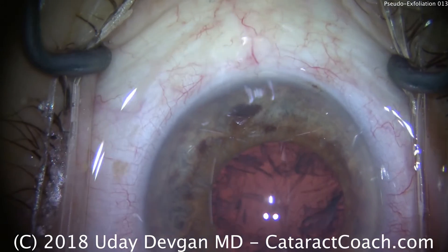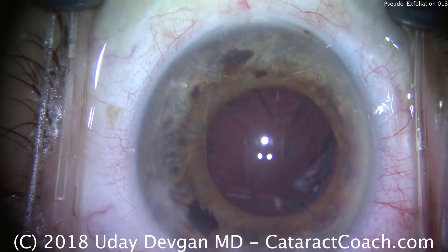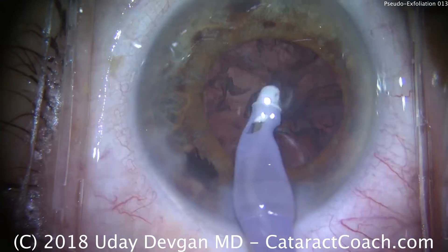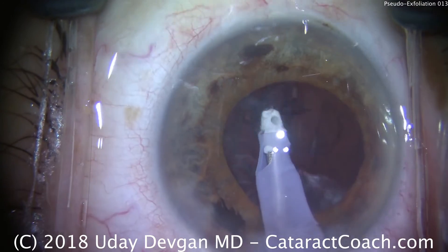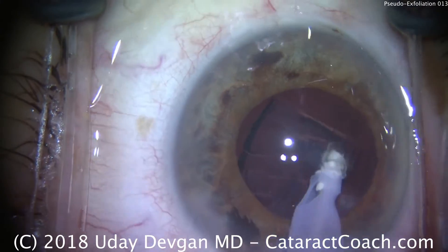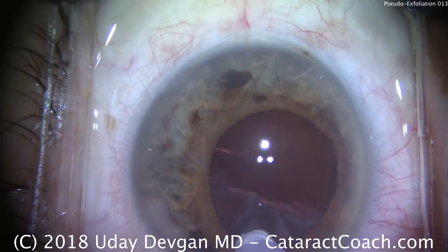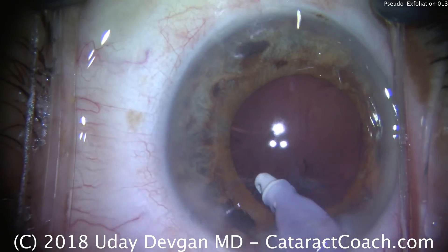At this point, we'll switch over to the IA probe to remove the cortex. When removing the cortex, we want to be careful that the zonules are holding on tight. Look at the edge of the capsulorhexis — we don't want to see the capsule moving. I'd like to grab sheets of cortex like we're doing here; I want just the cortex material to come loose and be removed. Take your time on this part — this should be done in slow motion. You want to remove as much of the cortex as you can, hopefully all of it, because residual cortex will cause unusual capsular contractions.